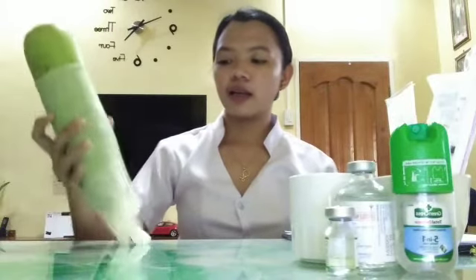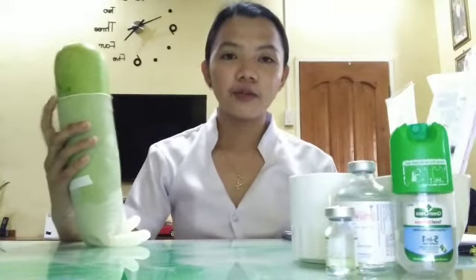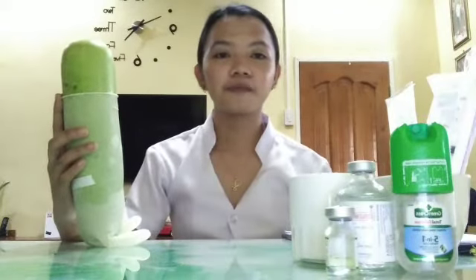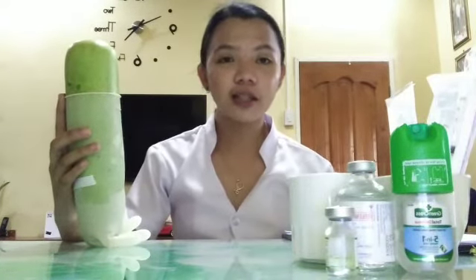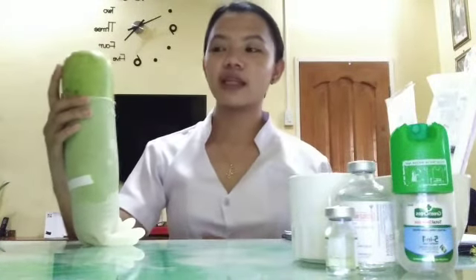In subcutaneous injection, it is a shot that is given to the fat layer between the skin and the muscle. In this procedure, we will be injecting to the site which could be on the deltoid muscle, on the lateral part of your thigh, on your lower back, or in your abdomen. This time I will be using the deltoid muscle.